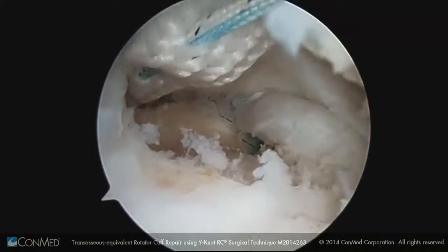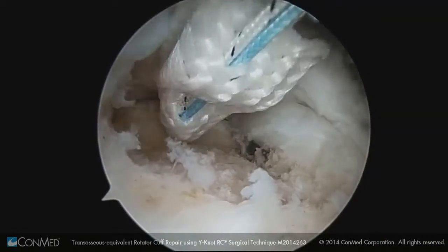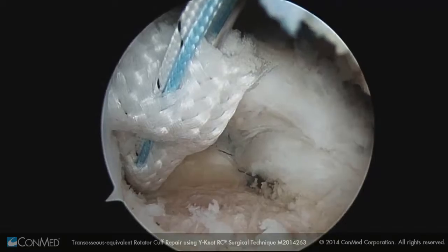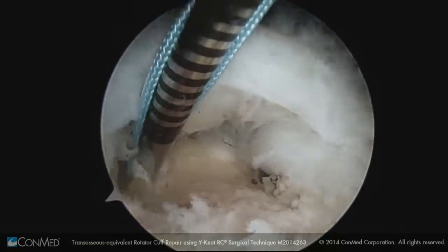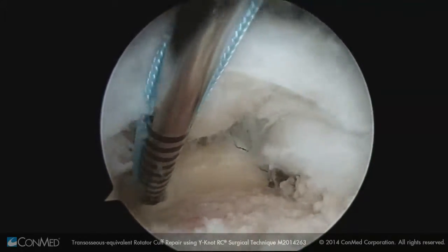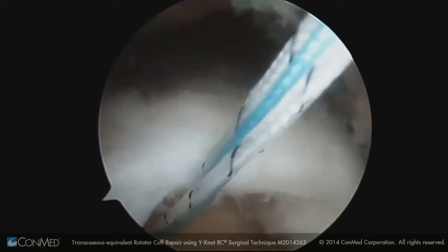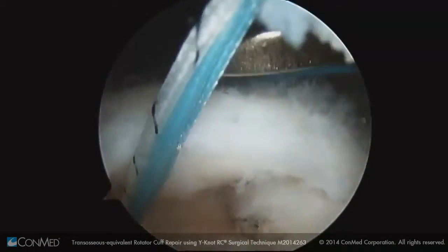Here's our second Y-knot RC being placed in a percutaneous fashion. There's good visualization there of the element of the anchor that will actually expand in subcortical fashion, which provides the excellent purchase. Again, we're selecting our spot at the cortical margin and driving the anchor in without having to tap a pilot hole. And also, once again, I will typically insert the anchor to the midpoint of the hashed lines. A firm pullback will set the anchor into subcortical position.